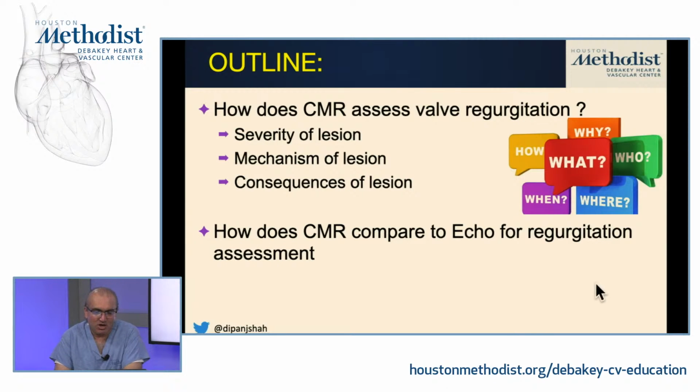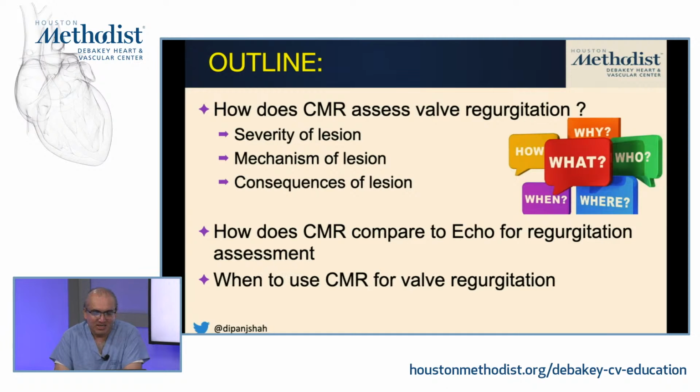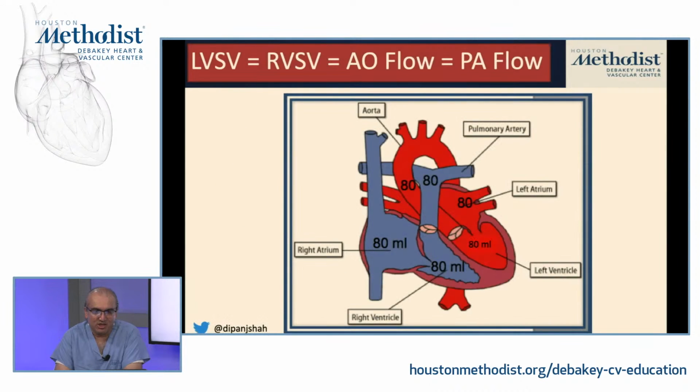We'll touch quickly on some studies that have compared echo and CMR for regurgitant assessment. And then really kind of wrap up by saying when is it that you would think about using CMR for assessment of valvular regurgitation.